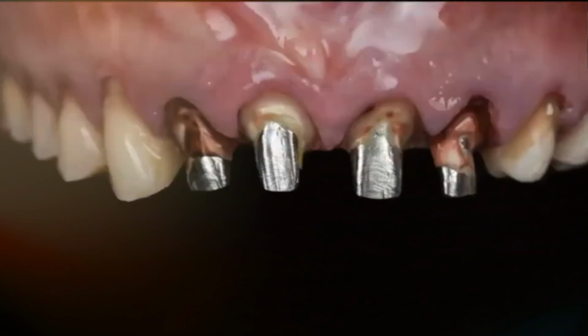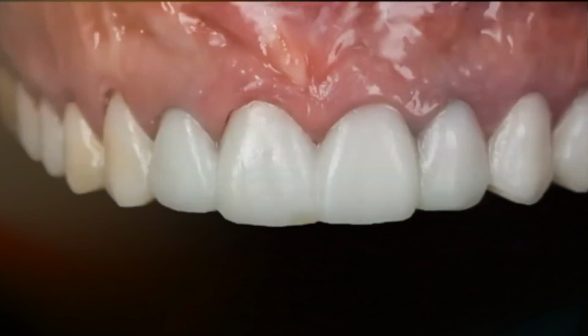So what I did here is I prepped, actually here I prepped like a double chamfer. So one chamfer where I want the restoration to start, and a second chamfer is more incisally, like roughly 2 millimeters to preserve the ferrule effect. So just not to damage the structure of this already damaged tooth too much. And then I scan this and I provisionalize, the patient goes home.